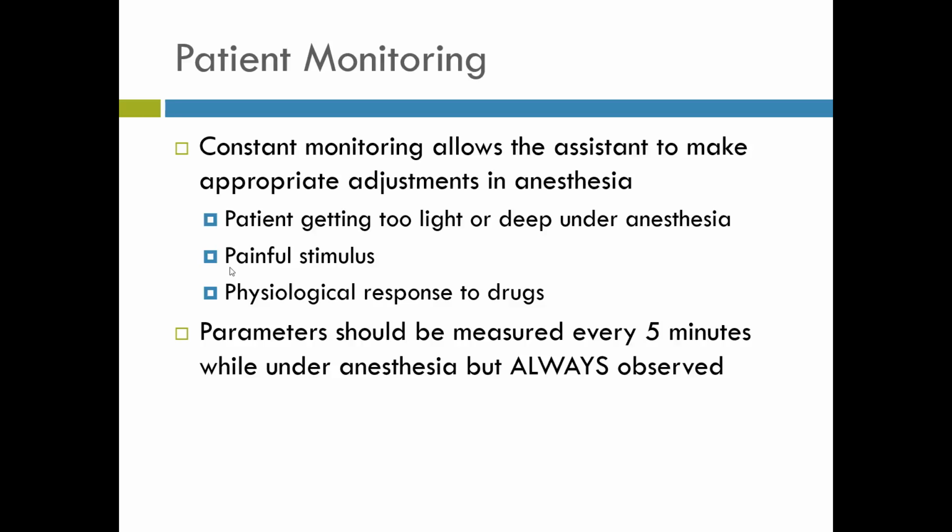Physiological response to drugs as well. Some of our drugs, like our opioids, cause severe respiratory depression. So with that monitoring, knowing what medications they're on, we are able to adjust our monitoring and our anesthetic gas accordingly to that patient's needs.